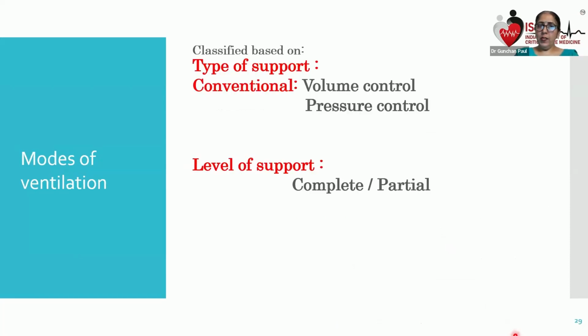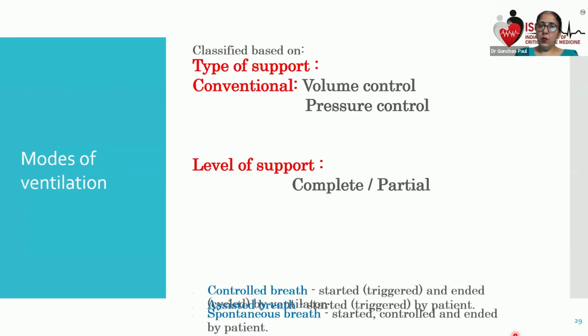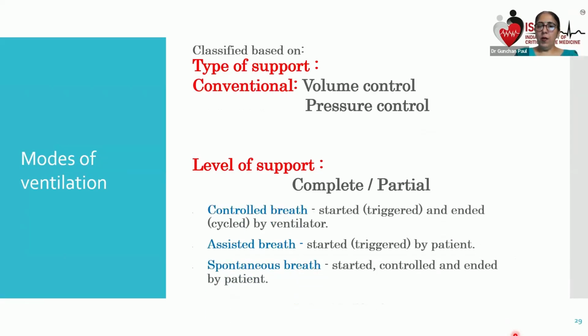So any mode of ventilation depends on volume or pressure, and what kind of support. Either it is complete support or partial support. Complete support means all the breaths are being delivered by the ventilator. Assisted means the patient is initiating the breath and the ventilator takes over. And spontaneous means the patient is the only one taking the breath.